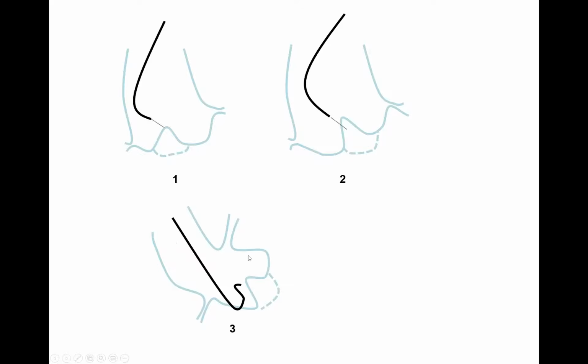So depending on that shape, you decide what catheter to use. Typically, frequently an Amplatz left is the best catheter to access the left ventricle in severe aortic stenosis or in those patients with elongated aorta. Amplatz left will sit here and will aim you to the hole in between the right and left cusp, okay? So I'll show you some examples here, okay?